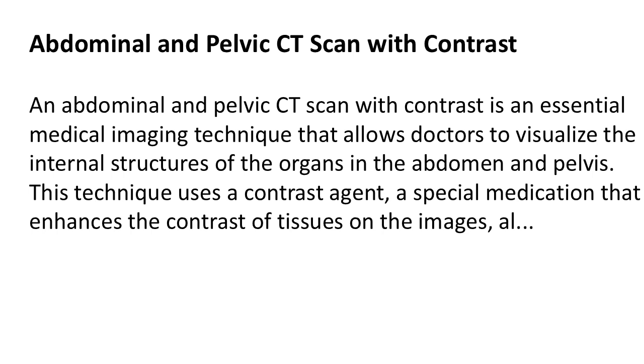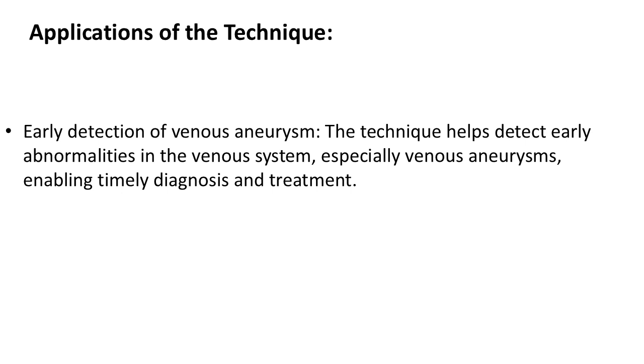Applications of the technique: early detection of venous aneurysm. The technique helps detect early abnormalities in the venous system, especially venous aneurysms, enabling timely diagnosis and treatment.